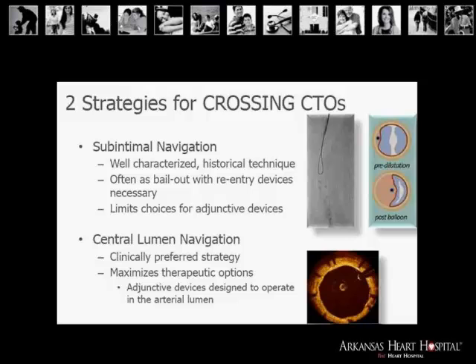Central luminal navigation would seem to be the clinically preferred strategy because it allows you to use whatever therapeutic option you desire. A lot of these atherectomy devices are made to operate in the arterial lumen, so this would seem to be more favorable.